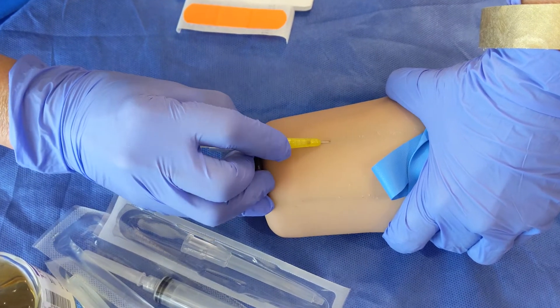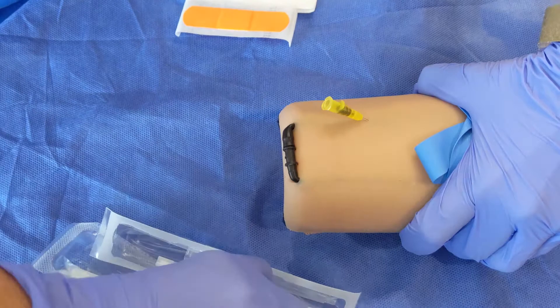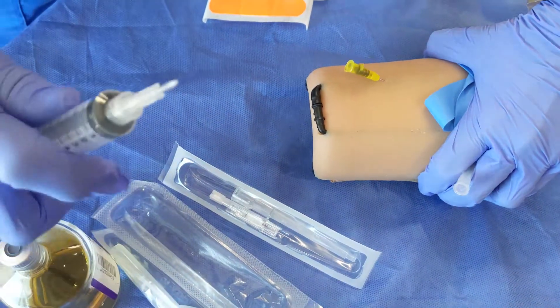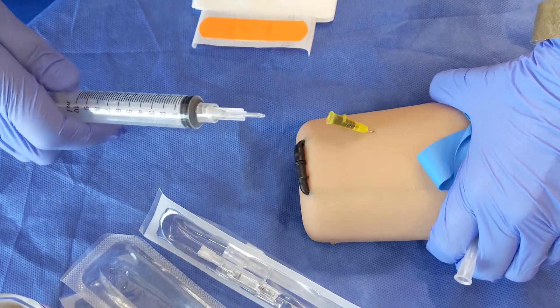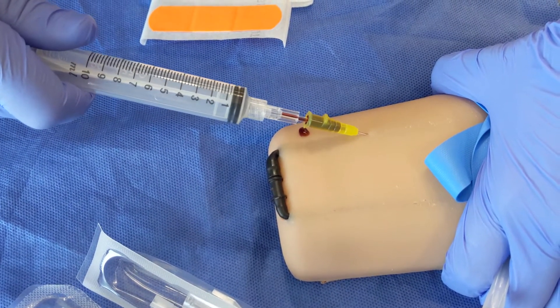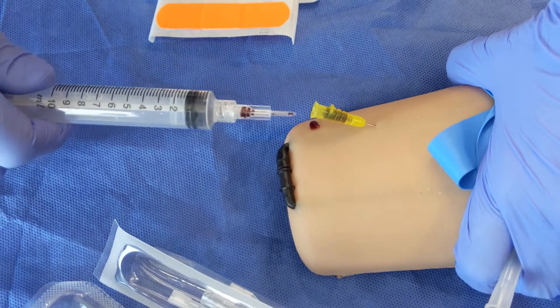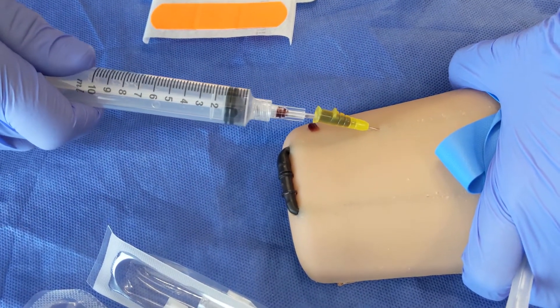I've got some flash. So this is the interesting part. You might need somebody to help you, but you can also just manage this yourself pretty easily. So we're using a blunt cannula on a 10cc syringe.